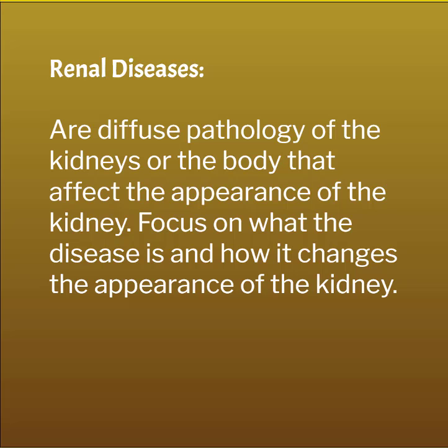And I say that it's a little bit more difficult because we are not so much diagnosing based off of what we are seeing, rather than that we know something is wrong with the patient and we are just seeing the effect that that disease has on the kidneys. So we're not going to go into most of these images saying, oh, we just diagnosed AIDS on this patient, or we just diagnosed lupus on a patient. What we're going to see is the effect of that systemic disease onto the kidneys.